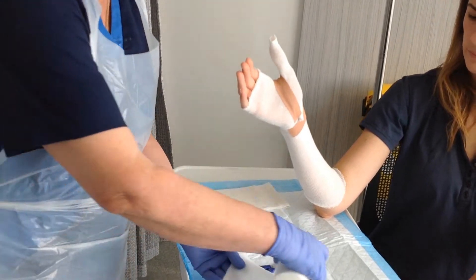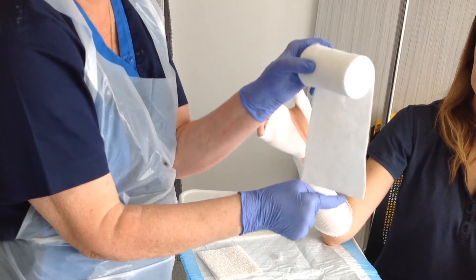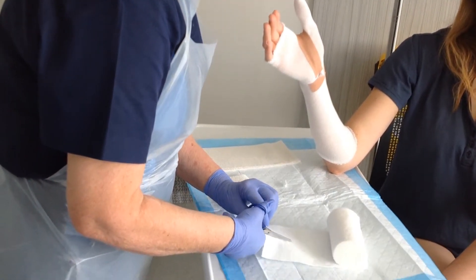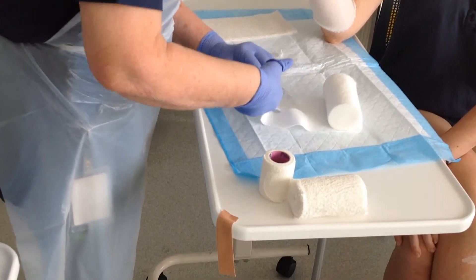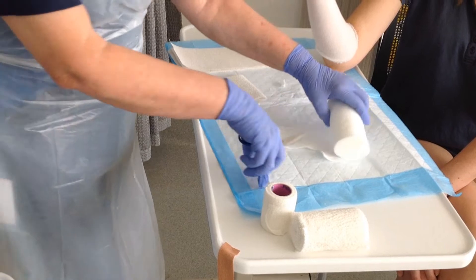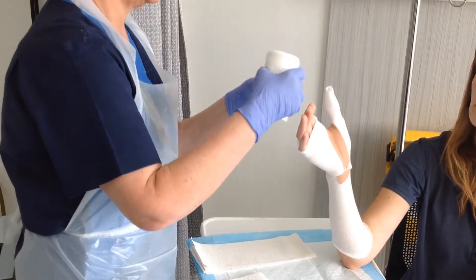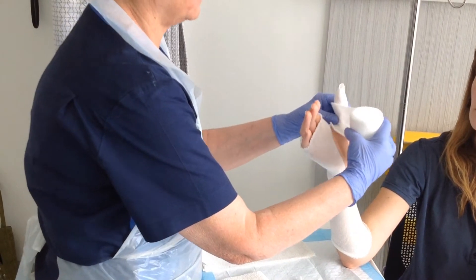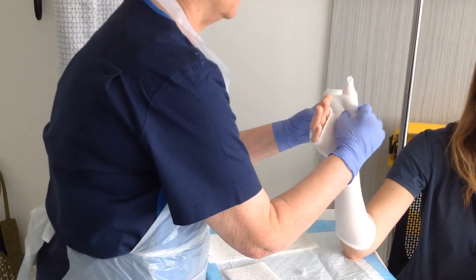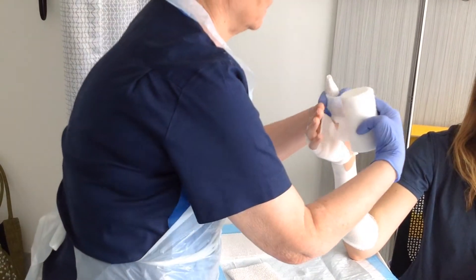We take our padding and cut a little piece of the material out just down through here — not too long. What we end up with is a shape like so. We're going to put that in the medial part of the thumb there, in the midline, and bring that round. Take it completely around the thumb so it's circumferencing the whole thumb.